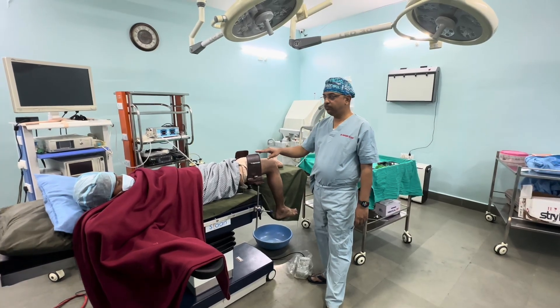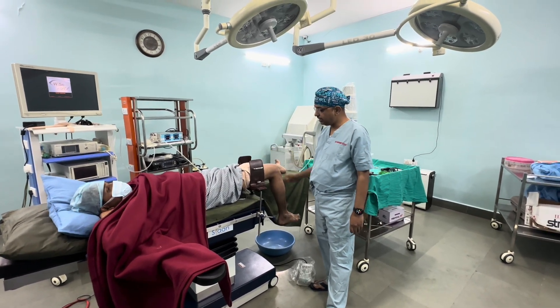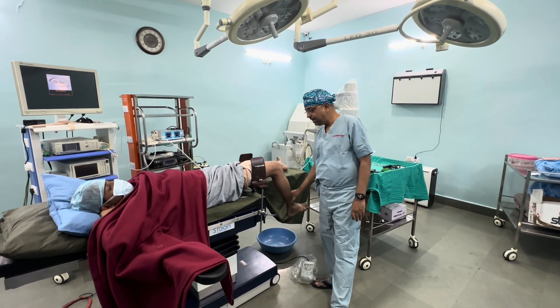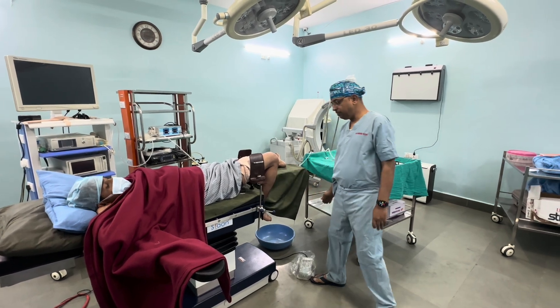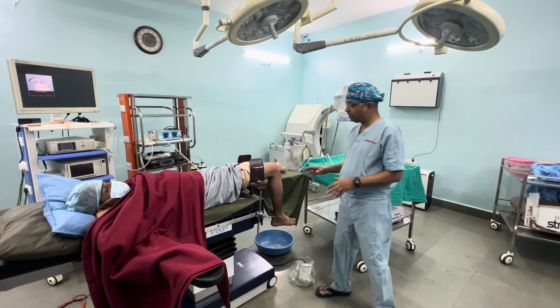We can also position the patient with high support and breaking the table so that the limb dangles freely and we can achieve hyperflexion in the same manner. This is also a very good way of operating because it reduces the need for assistance.